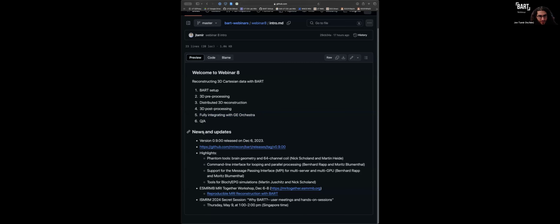I did want to talk about a few updates that we've had since the last webinar. We've released version 0.9.00 as the most stable release. If you go to this link, you can see the full release notes, including who contributed. In particular, I wanted to highlight a few of the main release notes.